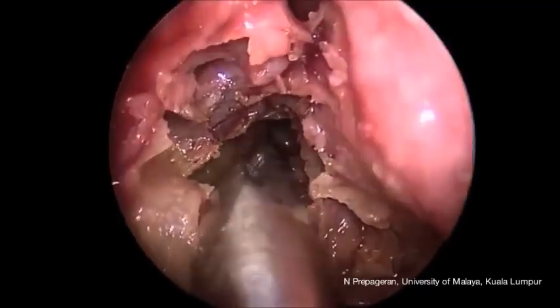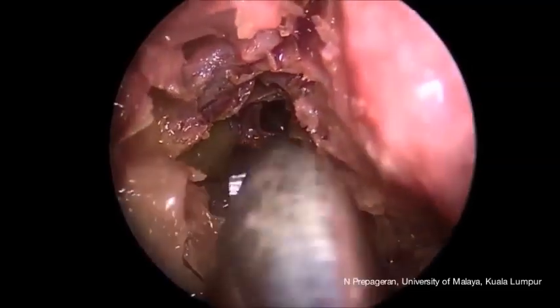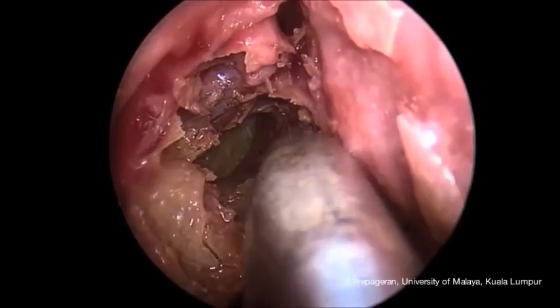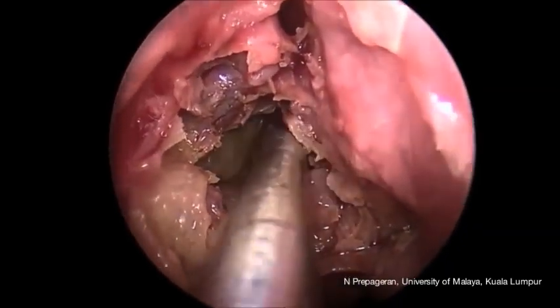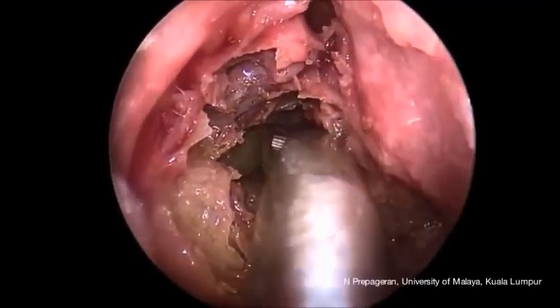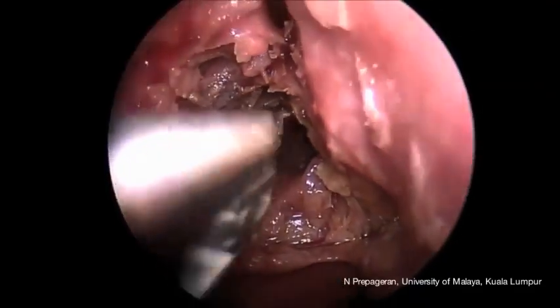Then we will be able to appreciate that lateral to the posterior ethmoids is the lamina papyracea, and medial to the posterior ethmoids is actually the superior turbinate, which will form a landmark on how to make sure that we are in the posterior ethmoids itself.